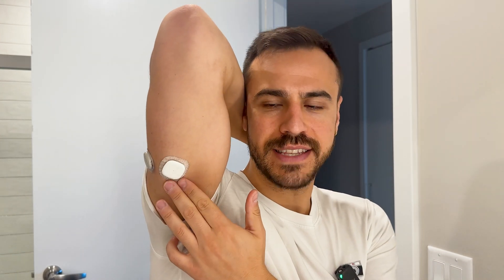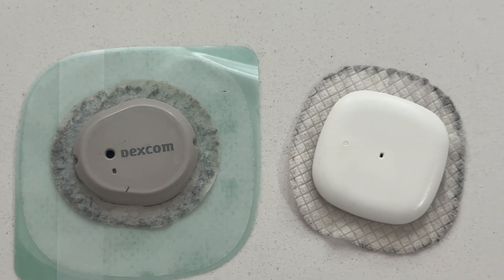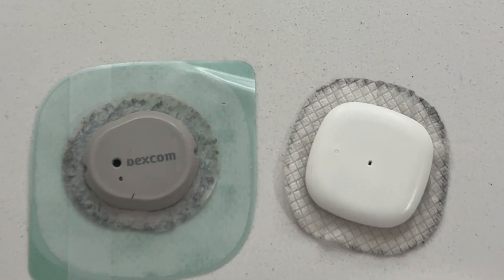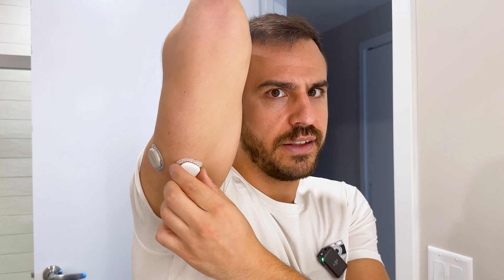After the full week, this is what the Simplera looks like — not so bad, pretty nice looking still, not so dirty. This is the Dexcom G7 after its full 10 days with the new adhesive, and as you can tell, it gets really dirty. Dexcom says they recommend you put the overpatch on, but that would be much larger than the Simplera footprint. Yeah, it's only seven days, but it still looks very clean and nice, and it is really on there.